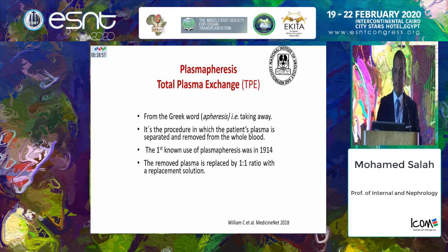Plasmapheresis, total plasma exchange, or TPE, comes from the Greek word apheresis, that is to say, taking away. It is the procedure in which the patient's plasma is separated and removed from the whole blood. The first known attempt of doing plasmapheresis with the concept that we use nowadays was in 1914, yet the first plasmapheresis sessions attempted successfully were in the 50s of the last century.